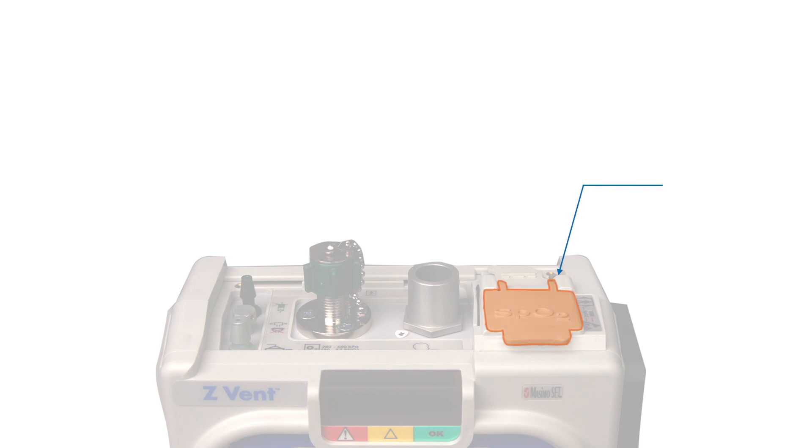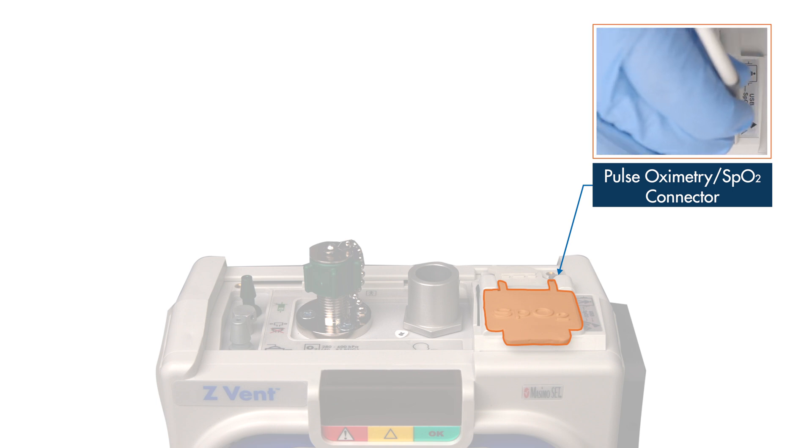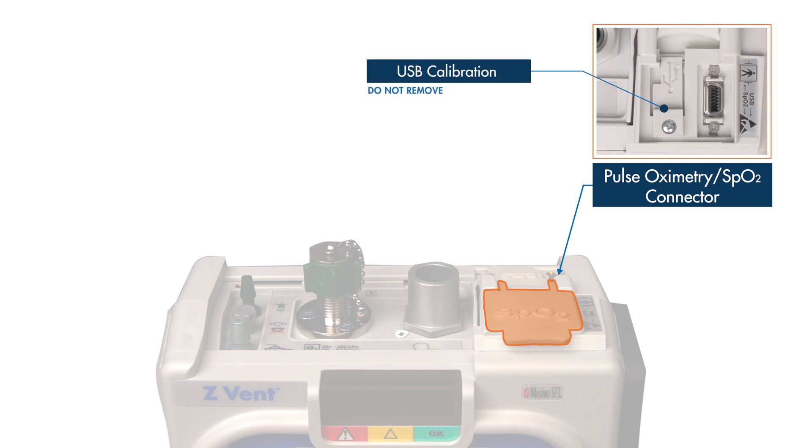At the bottom right corner is the pulse oximetry connector under the square rubber cap labeled SpO2. The Massimo LNCS series of probes are approved for use with the Z-VENT. When the appropriate sensor is connected, the pulse oximeter provides continuous non-invasive monitoring of SpO2 and heart rate for adult, pediatric, and infant patients. Note that the USB port under the screw cap is used only when servicing and calibrating the device and should not be removed by the user.